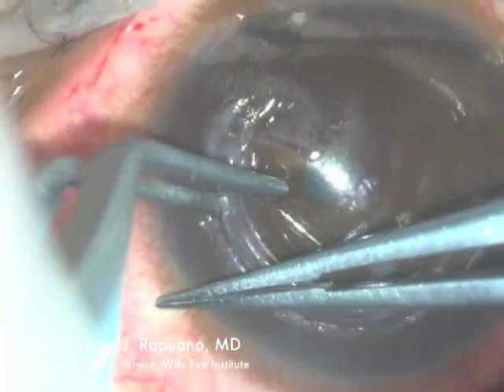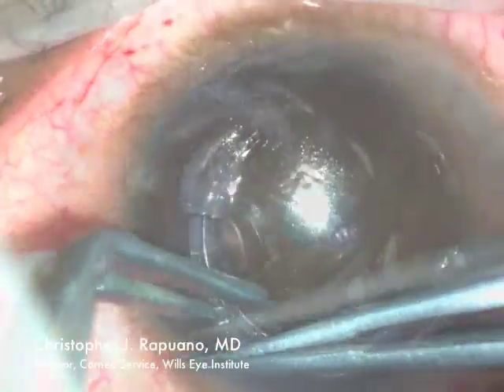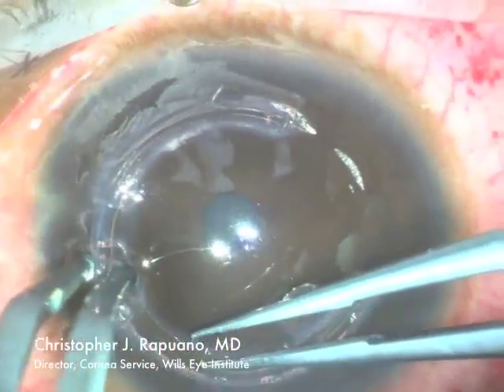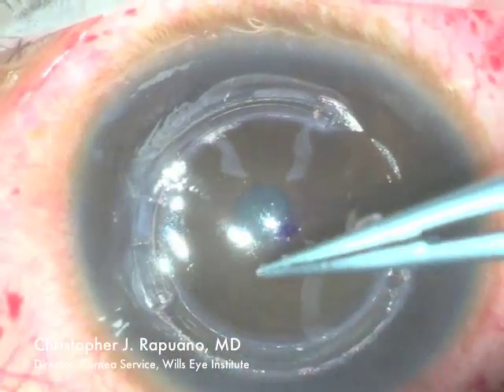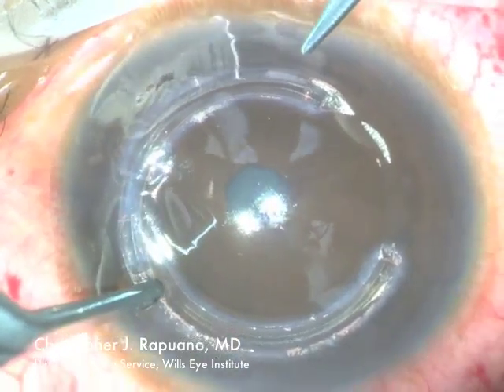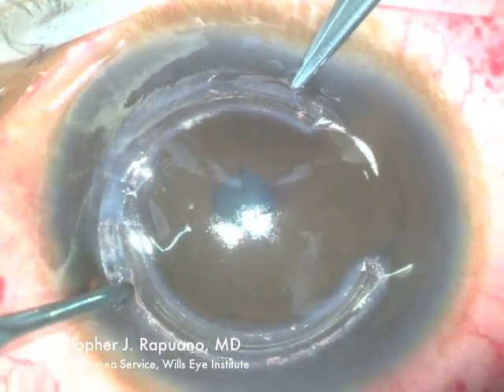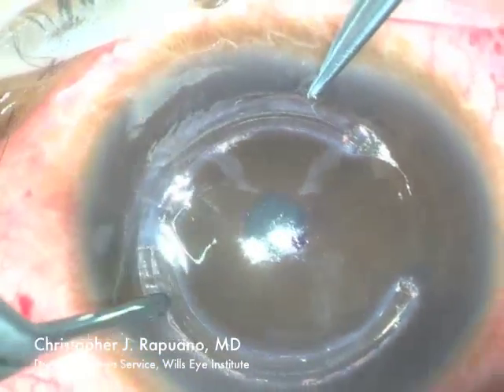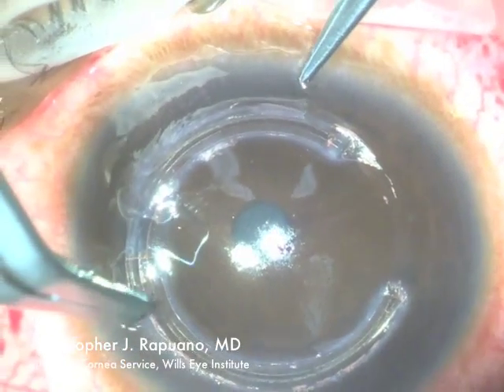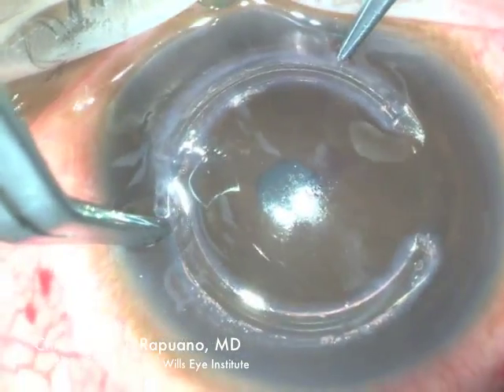Here it's being pushed deep into the wound, and once the channel is found, it can then be gently — but sometimes somewhat forcefully — rotated into its channel. A second instrument is again being used to give a little bit of pressure to move it around the semicircular stromal incision that was made by the femtosecond laser.